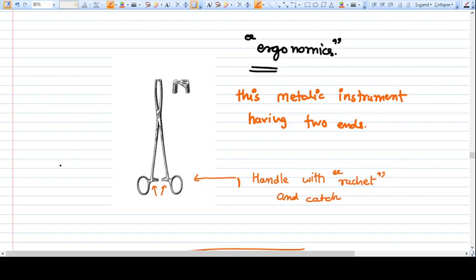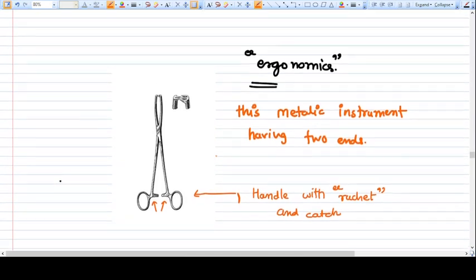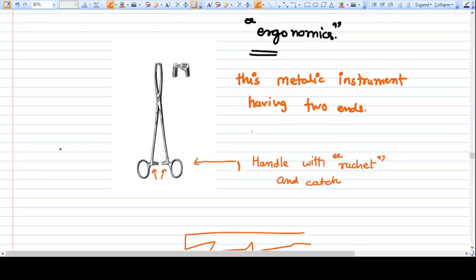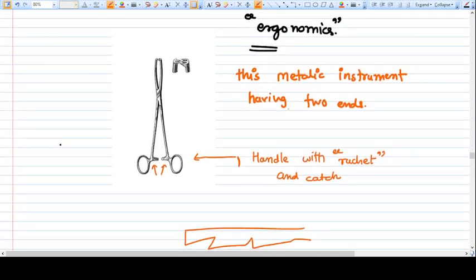Each and every perfect surgeon must understand the design of the instrument they are using - the ergonomics and how the instrument works. This is Alice forceps, a very important and useful forceps that is always there in every surgery. This is a metallic instrument having two ends.